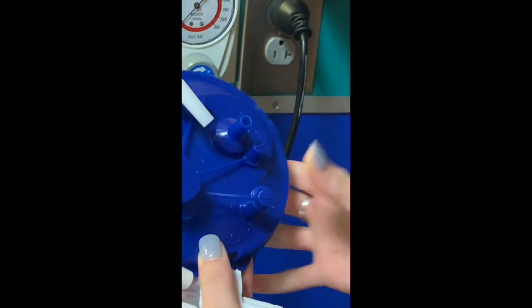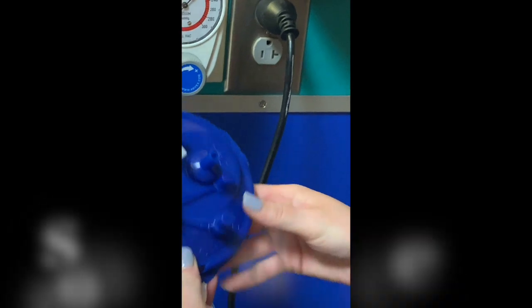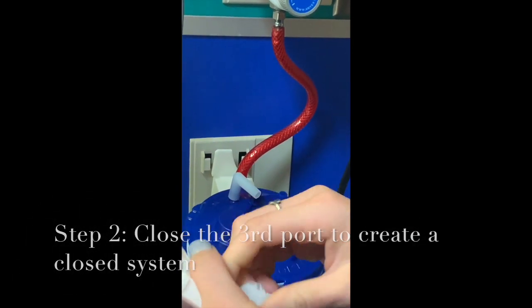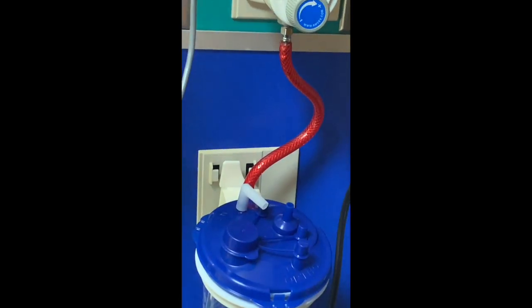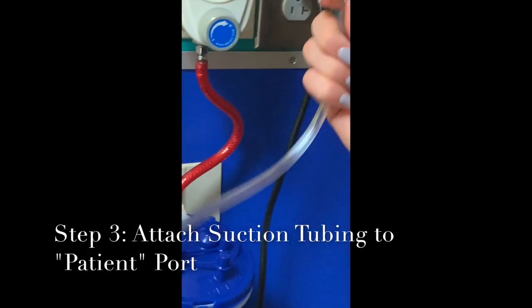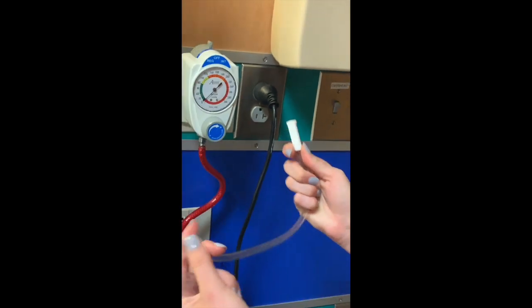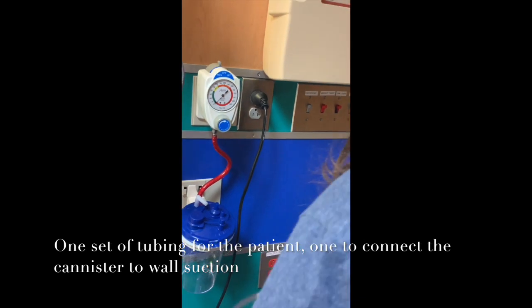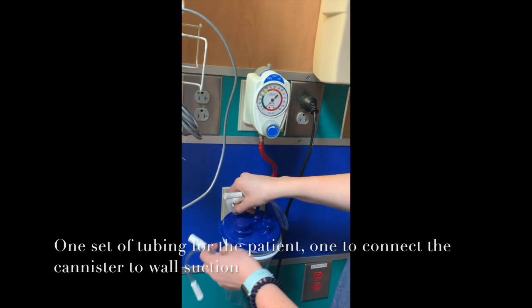How we do it, this is always plugged in. You always want, obviously, the patient to be attached to your patient or whatever you're using to suction. Your tubing comes in two separate parts. So, I'm gonna take this off.